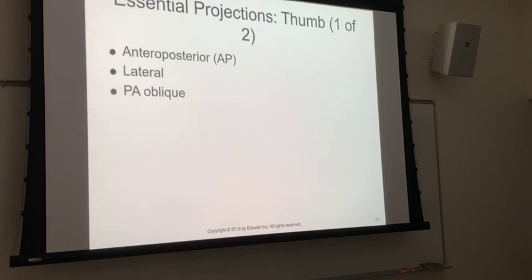So it's not prone. Your hand is prone, right? Your hand is prone. But your thumb is oblique. It's not lateral, it's not prone, it's oblique. So when we talk about the oblique, PA oblique, what position do you think your hand is going to be in to give you oblique of the thumb? It's prone, right? So naturally it gives you about a 45 degree prone position.